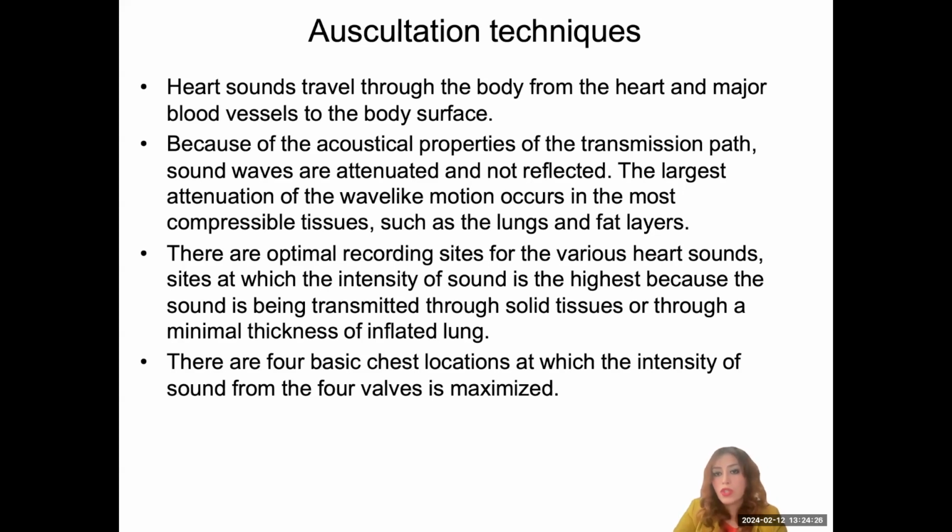So sound transmission velocity changes according to tissues. In air, the velocity of sound is small. It's 5 times lower than in liquids and 20 times lower than in solids. And also our tissues have their own acoustic impedance values, so because of this, it can change.